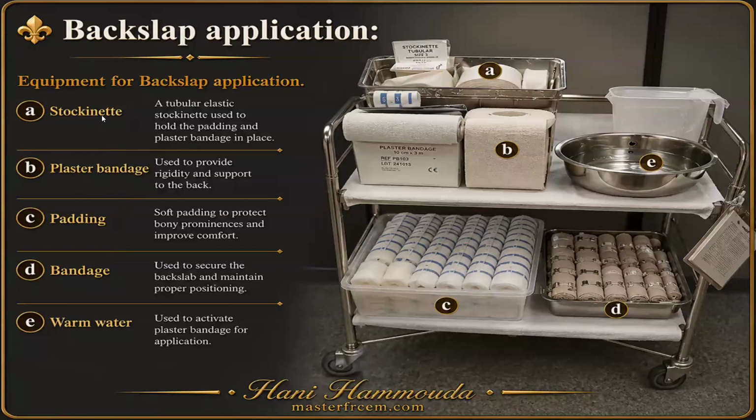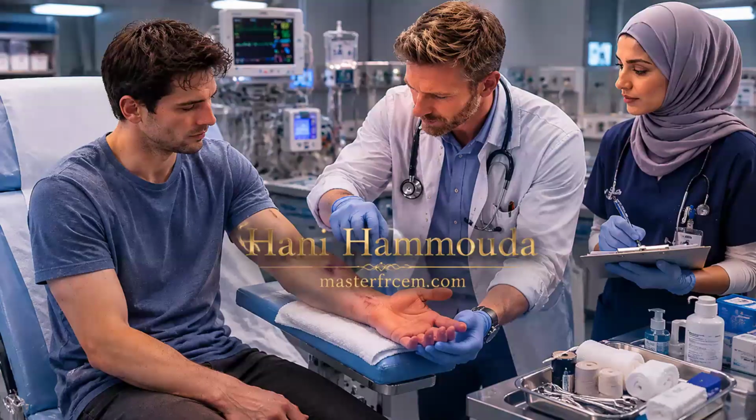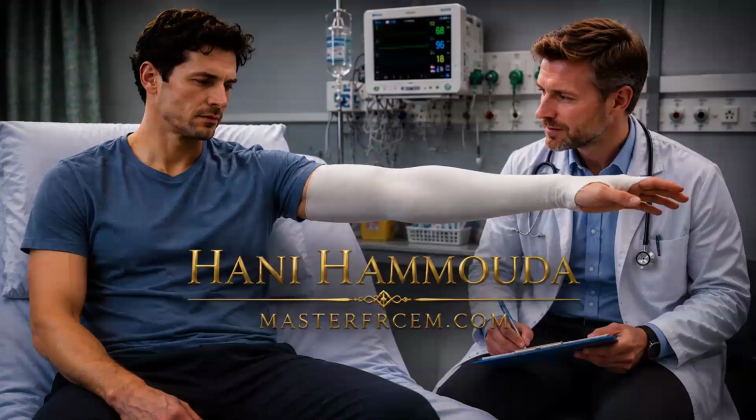So you will start number one by stockinette. Once you apply stockinette, you will apply padding, then plaster bandage, then you will apply crepe bandage. So the first step, after examination, you will ask the patient to extend the arm in pronation. Then you will cover with stockinette.